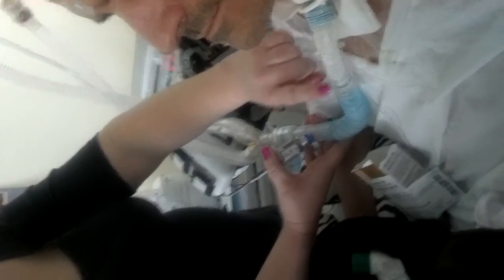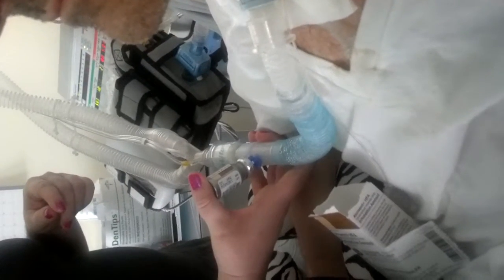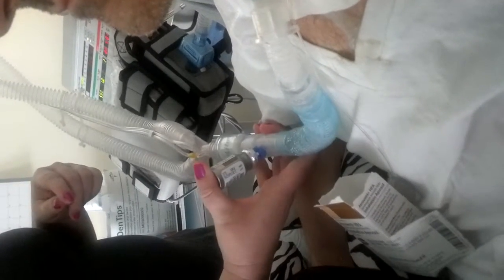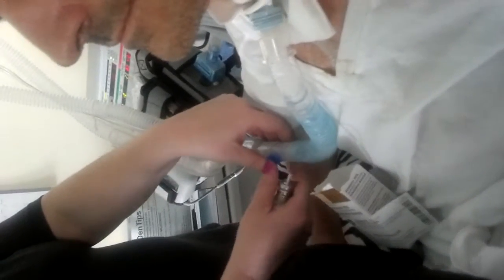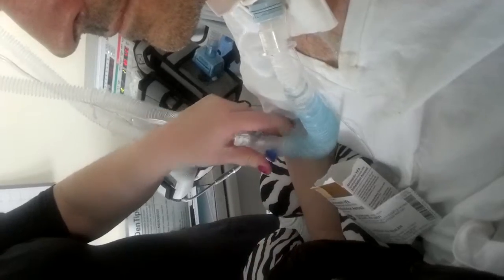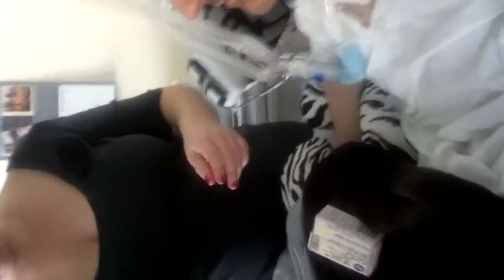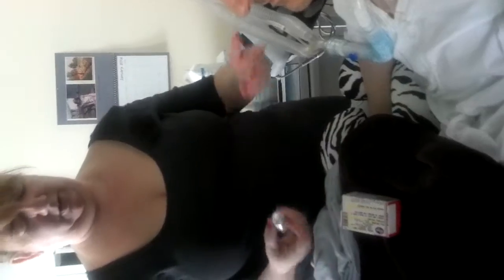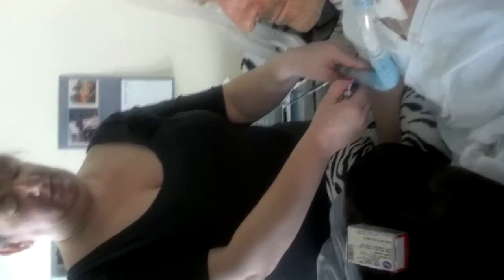You can watch through here — you can see the medication I'm bringing in. It was two puffs with this one. Go ahead and close it back up. You'll notice that when you open this, you're technically breaking the circuit open, but the ventilator is not alarming because the pressure sensitivity is not set to where it would alarm with just this little bit of opening. However, he isn't getting the same amount of pressure when it's open. So, even though the ventilator is not alarming, you need to make sure that you close that back up.